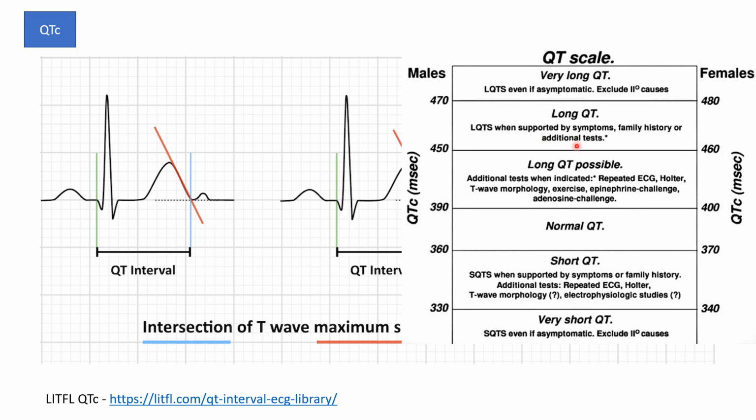What's the upper limit? Some references would say that above 500 milliseconds, there is a higher risk for Torsades de Pointes.